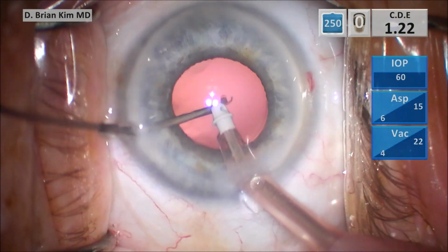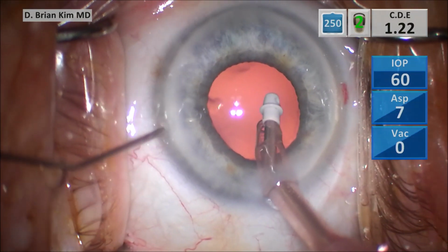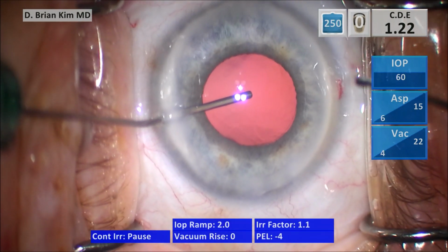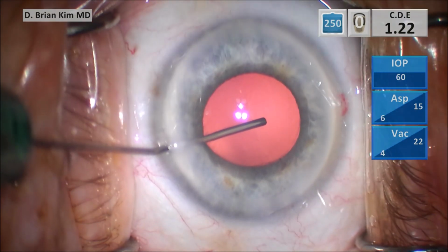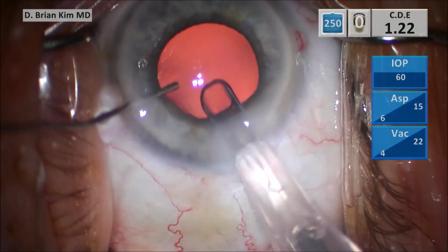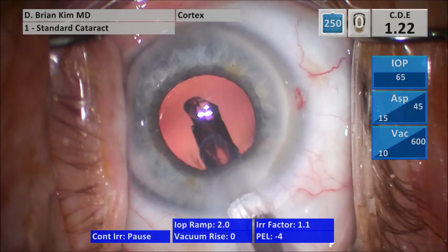And it's fairly clean in this case. Go ahead and inject some cohesive viscoelastic to fill the bag. Because the pupil is small, I'm not going to really polish, because all it will do is liberate more iris pigment as I try to sweep. So I go ahead and place the single piece acrylic lens into the capsular bag.